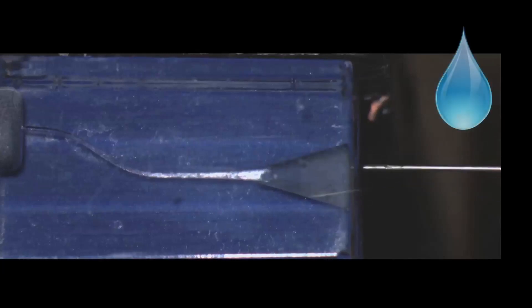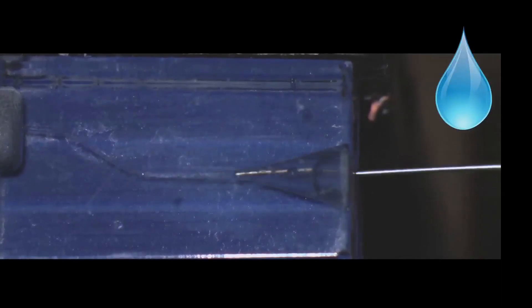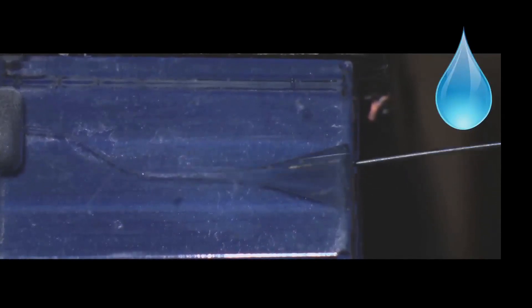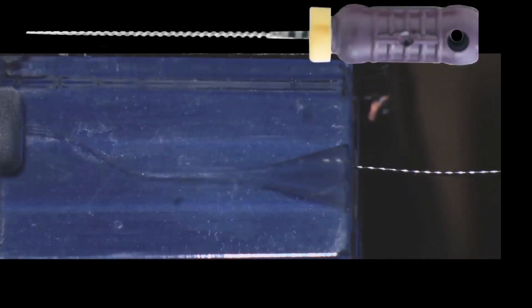We are going to be able to achieve a very good working length with WaveOne Gold. Let me take you through a plastic block. Here we have irrigations — a critical part of root canal therapy. We irrigate. Now we are going to establish patency in the canals.